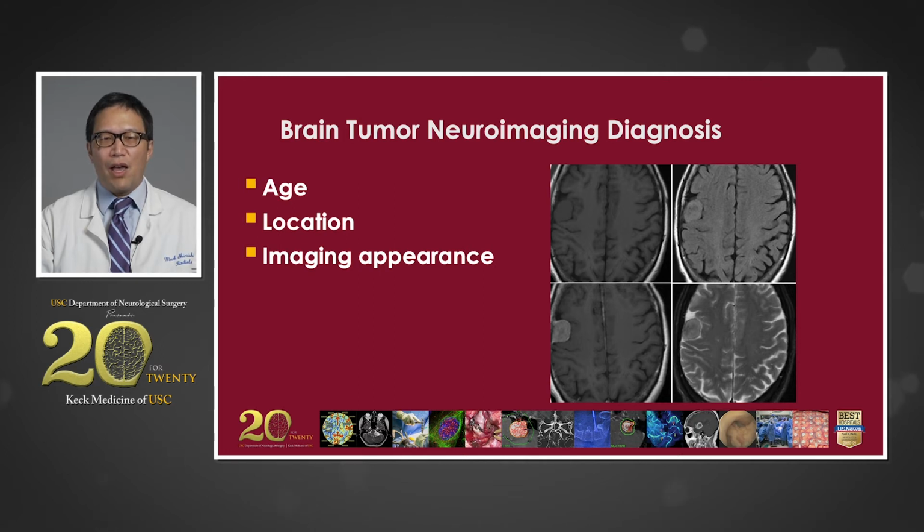The image below that on the bottom left is after the administration of a contrast agent. We often will give a contrast agent to make sure that the lesion doesn't enhance or may enhance, and the characteristics of the enhancement pattern can also help differentiate different types of lesions. In this case, meningiomas characteristically have uniform contrast enhancement, are generally uniform on T1 weighted imaging, as well as on T2 weighted imaging, which is the bottom right image.